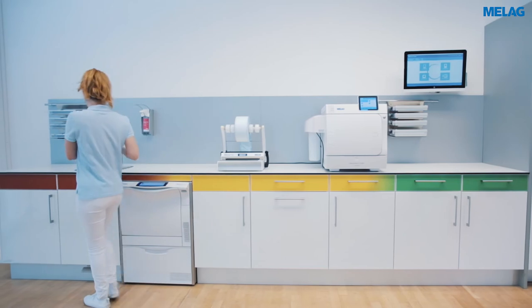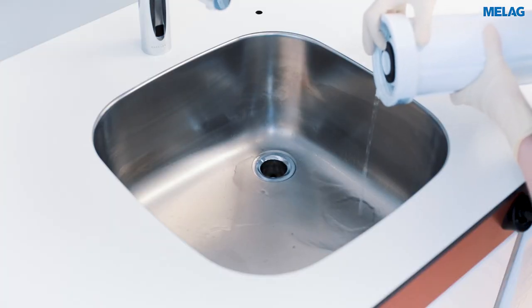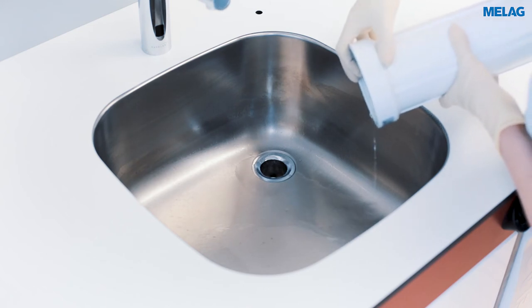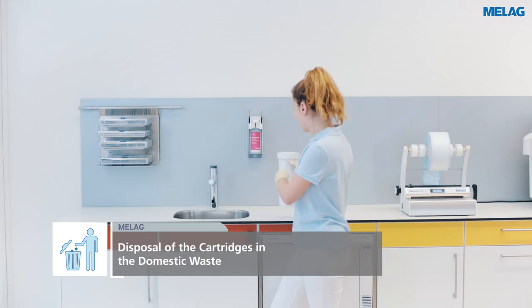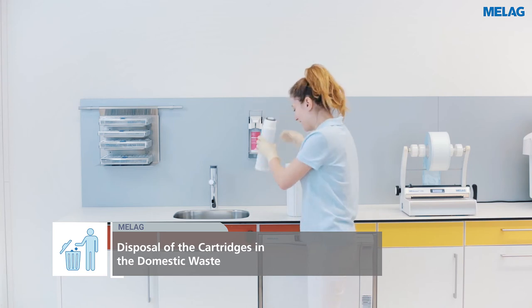The water in the cartridge container can be poured into the drain. The exhausted cartridges can be disposed of in the domestic waste.